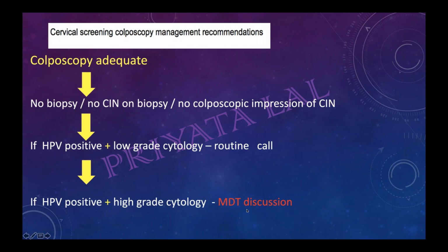So what will we do? Okay, let's discuss this in an MDT. Because of this disparity, MDT discussion is important. This is important to understand for both part 2 and part 3 people, because only from this line you will get a question. So I'm repeating this line again. Patient has HPV positive. You are doing colposcopy. On colposcopy, you are very happy. You never found anything. Then you saw her notes. Her cytology is high grade.